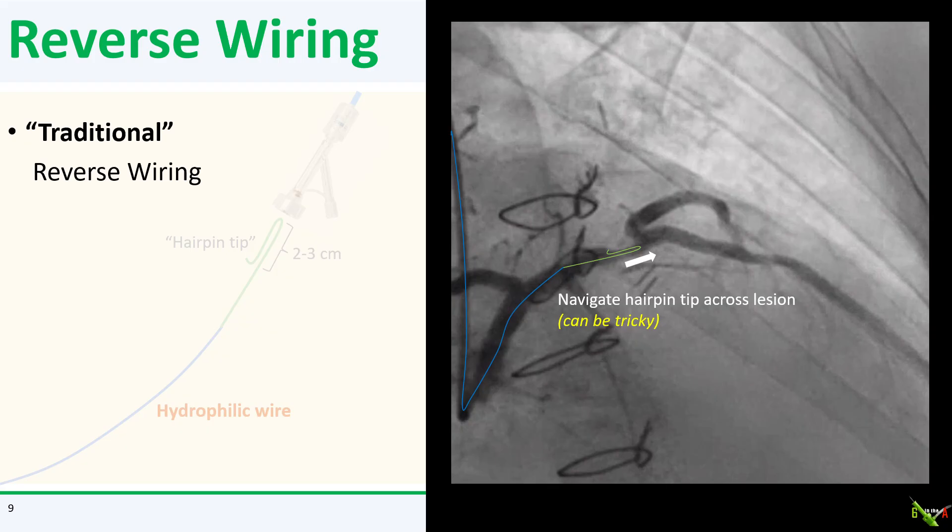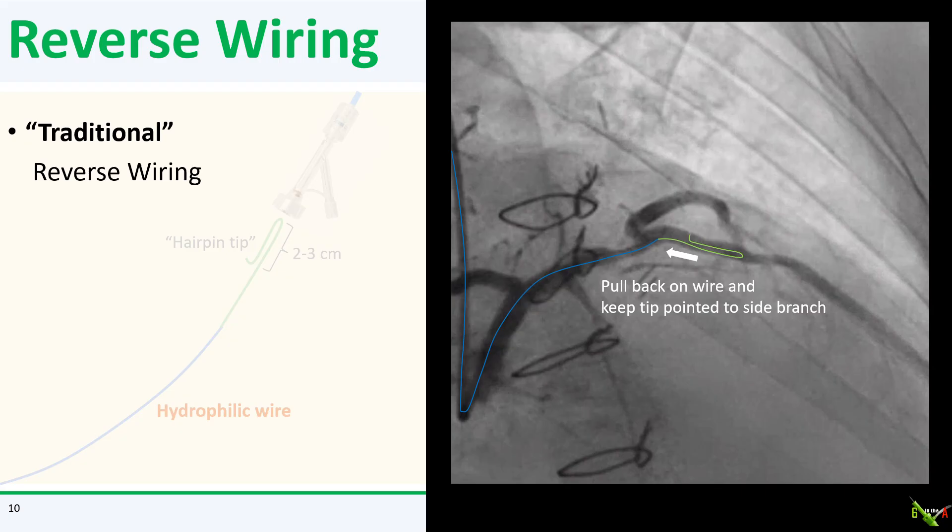It's also best to have the main branch wired with a separate wire beforehand, so that in case you end up dissecting with your hairpin tip, you have protection. Once you've crossed your target bifurcation, you then gently pull your wire back, trying to keep the tip of your wire pointed toward the side branch. With some gentle manipulation, you should be able to engage the side branch as you're pulling back the wire. This can be quite tricky to do actually.